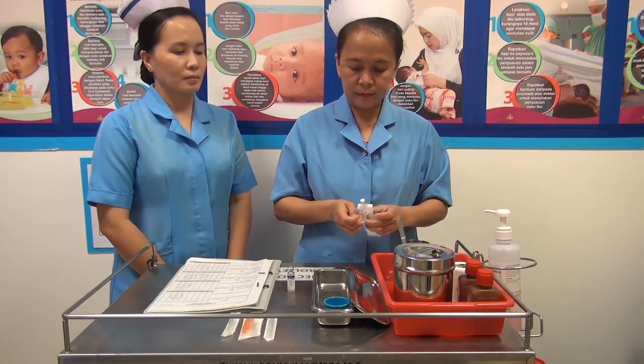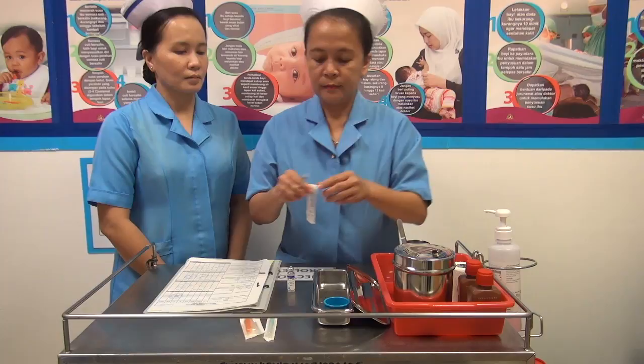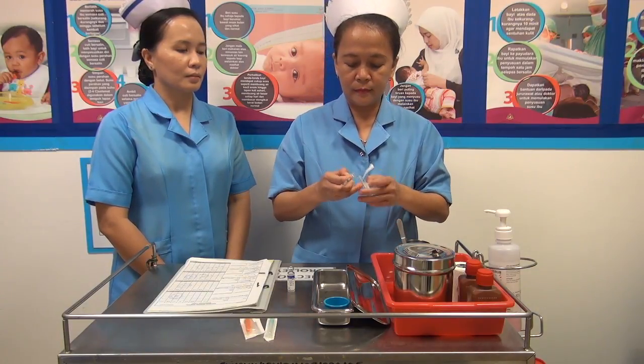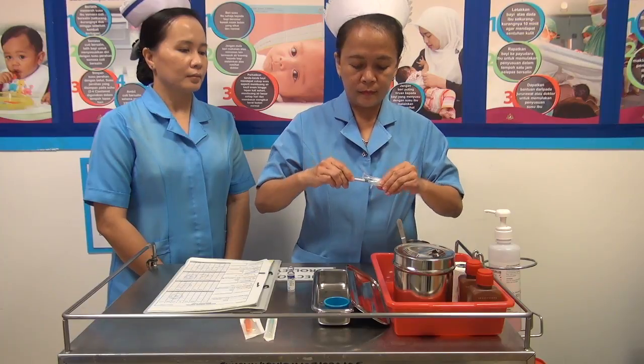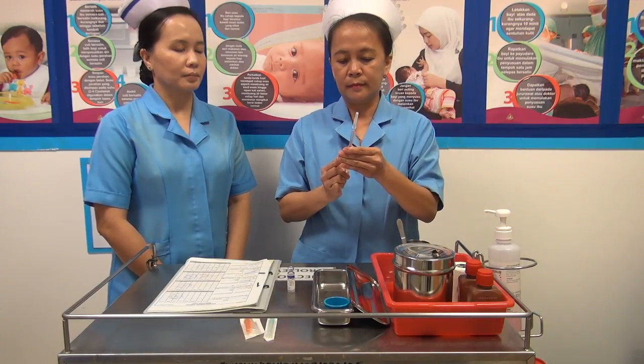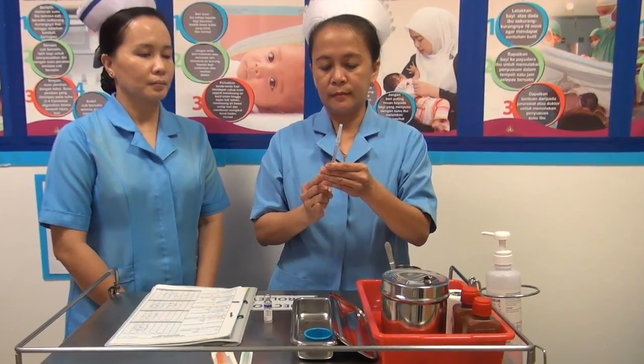Next, attach a 21 gauge or 23 gauge needle to a 1 cc syringe. Withdraw 1 cc of air, which will be injected into the heparin vial later. This is to facilitate the withdrawal of heparin from the vial.